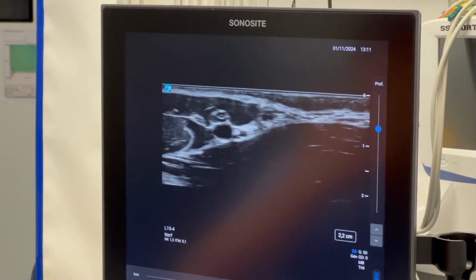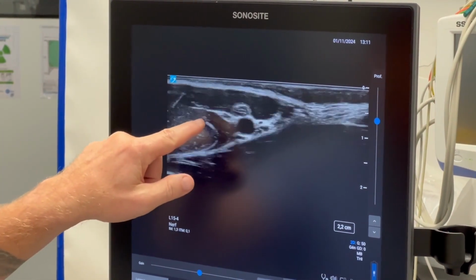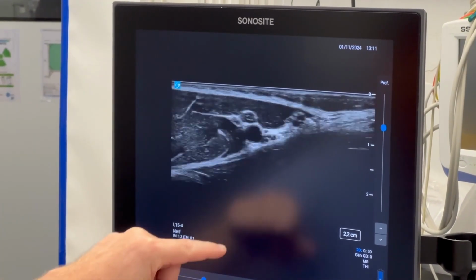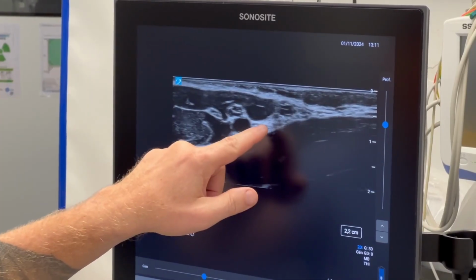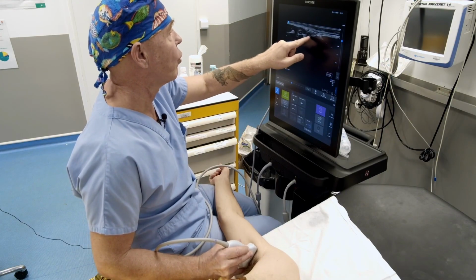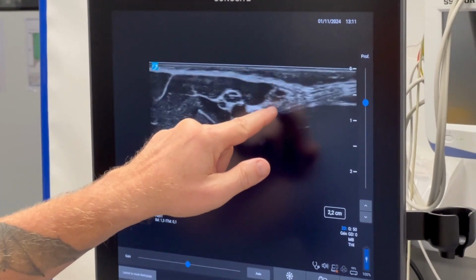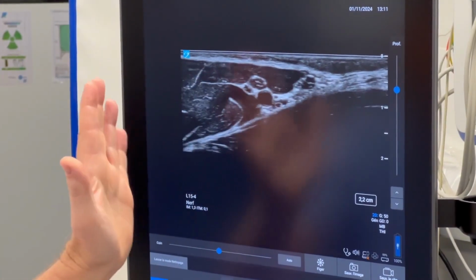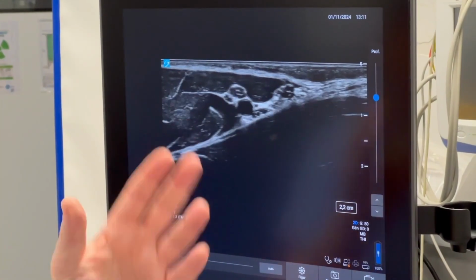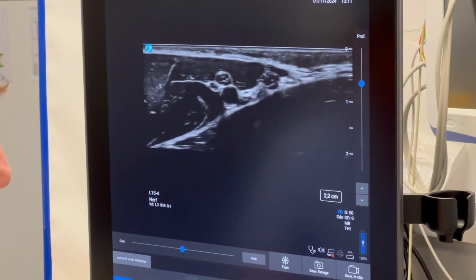Once again, we can identify the elements from step 1, namely the musculocutaneous nerve, which is clearly visible right here, and the median nerve. The radial nerve, and then when we tilt the probe just a little and follow dynamically, we can clearly see the anisotropy. Anisotropy is a concept I forgot to mention to you earlier. In fact, during the dynamic tracking, the nerve retains its properties, keeps its nerve shape. This is precisely what distinguishes it from a fascia or a tendon.